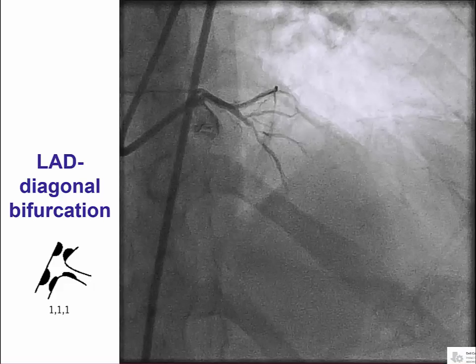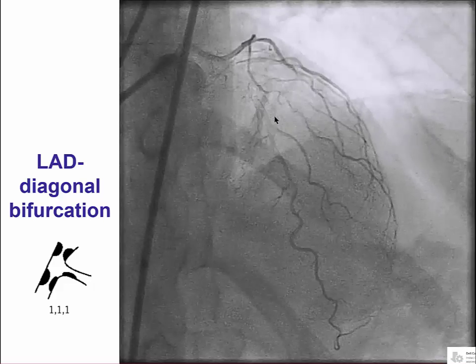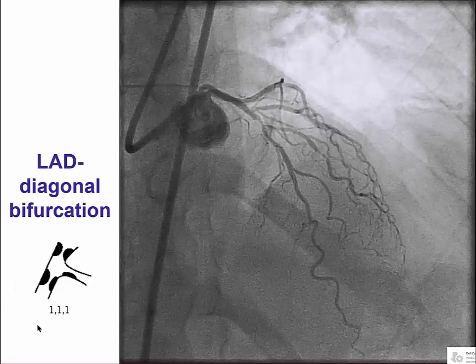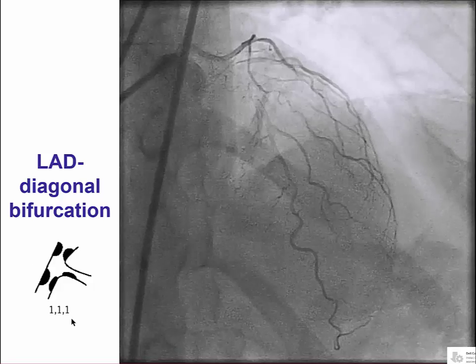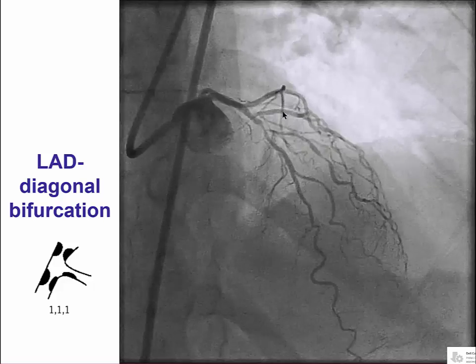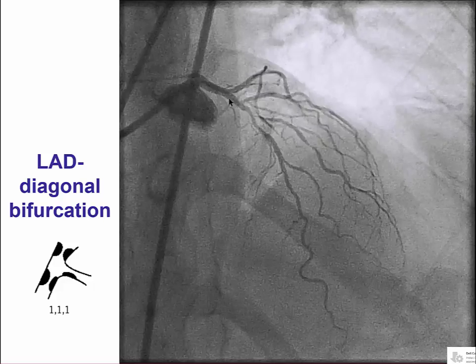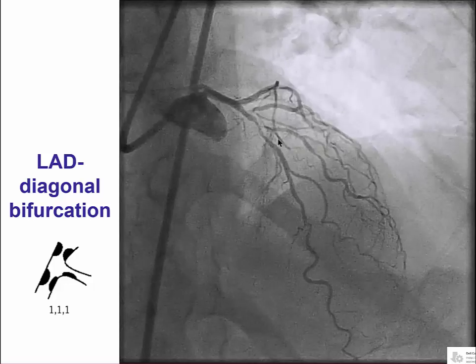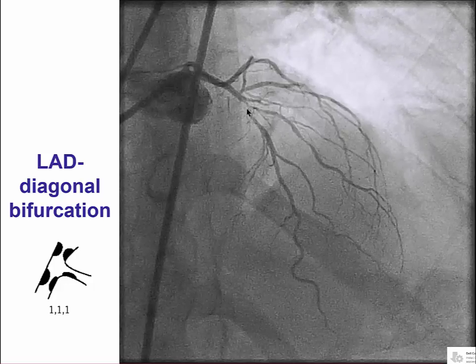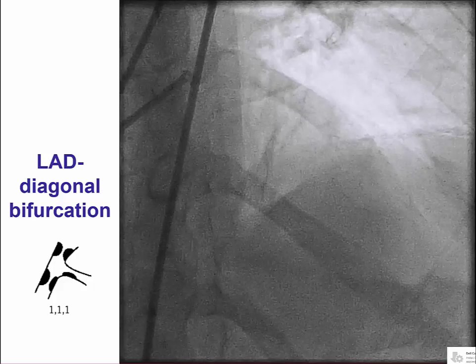This is a patient who has an LAD diagonal bifurcation. This is a Medina 1-1-1 bifurcation lesion because there is disease both proximal to the side branch as well as distal to the side branch in the main vessel, which is the LAD in this particular case, and also there is disease in the ostium of the side branch.